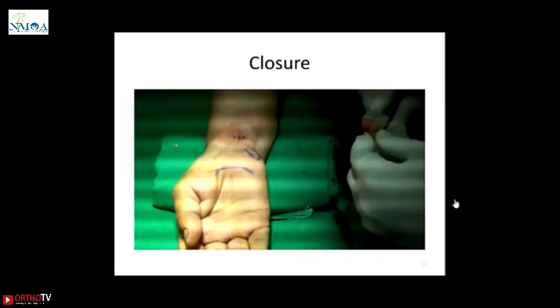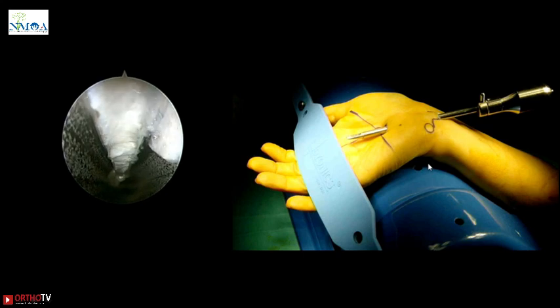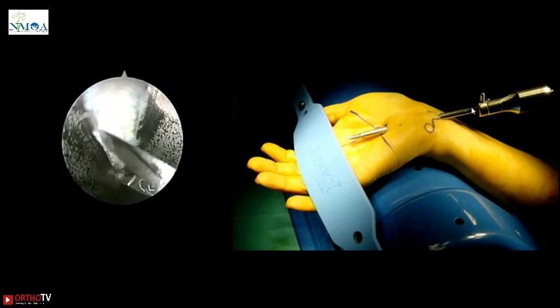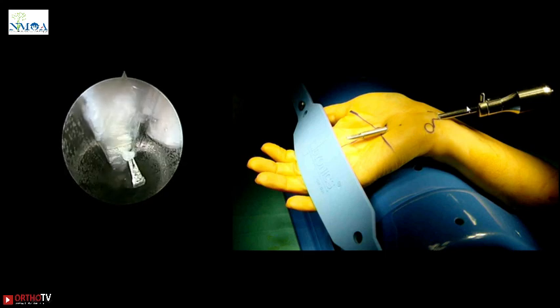Now, after that, I have stopped doing single portal. Now I have been doing double portal. So for double portal, I have got the instrument for that. So this is the palmar arch. Just before that, you exit the portal, pass your slotted cannula.